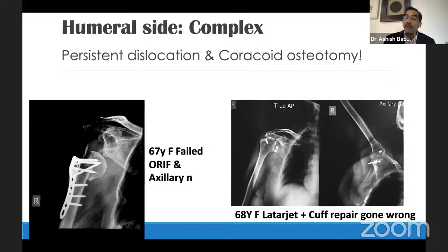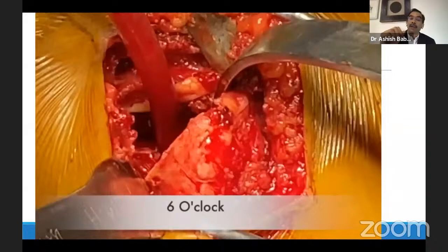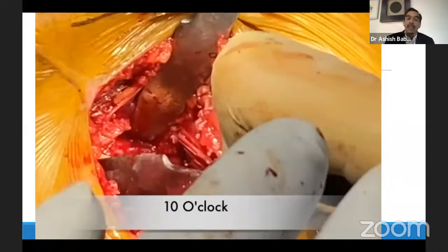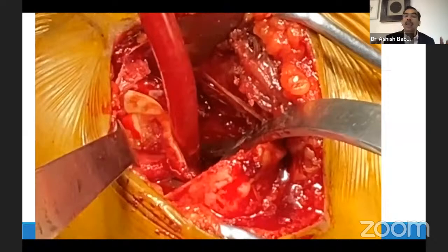plexus. So on a deltopectoral approach here, on the left shoulder, I'm bringing in my wire retractor here, tuck it underneath the glenoid. And when you pull it down, it's not only exposing the glenoid, it's taking the shaft of the humerus away. That's very important, which has a stem inside it. And then I come in with a sharp Homan at 10 o'clock, and then another Homan at 2 o'clock. So this is my standard positioning of my bone levers at 6 o'clock, 2 o'clock, and 10 o'clock. And this will open up the window completely.